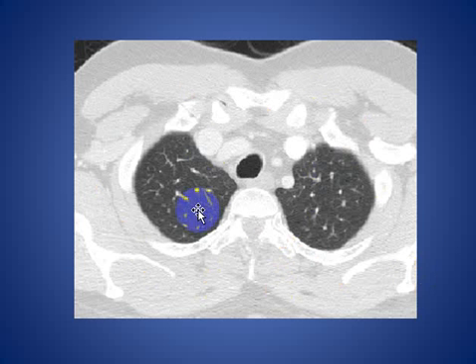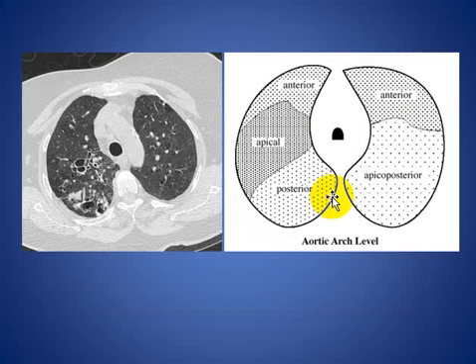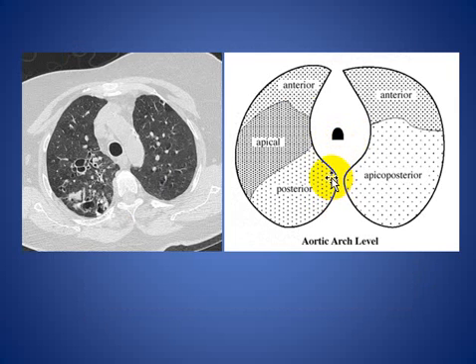At Level 1, above the aortic arch, we only see the apical segment of the right upper lobe and part of the apical segment of the left upper lobe. This is the second level, at the level of the aortic arch.